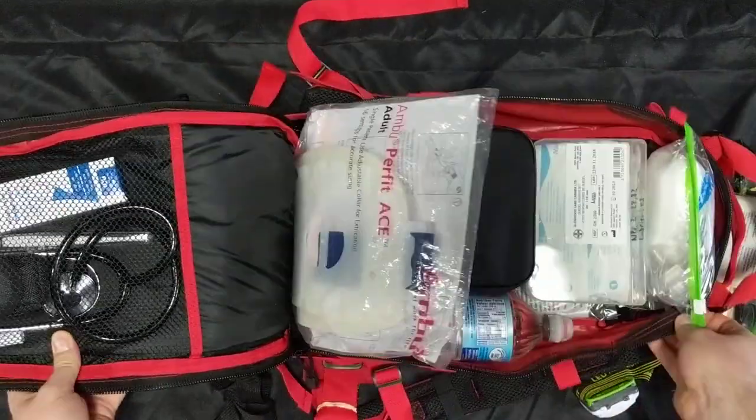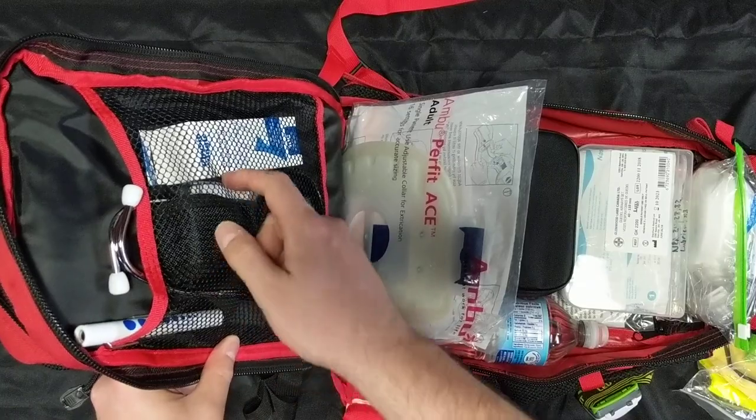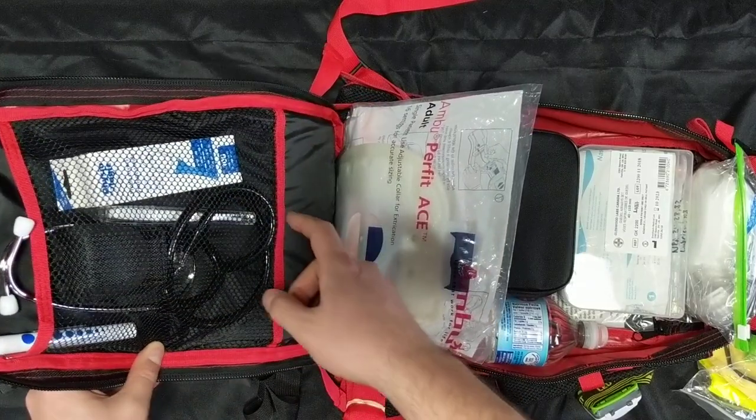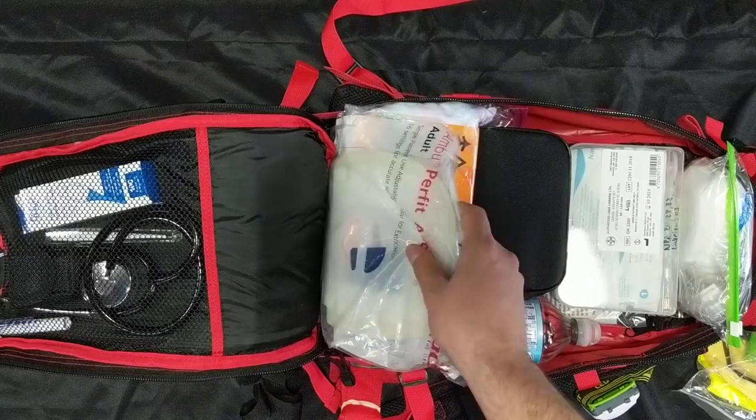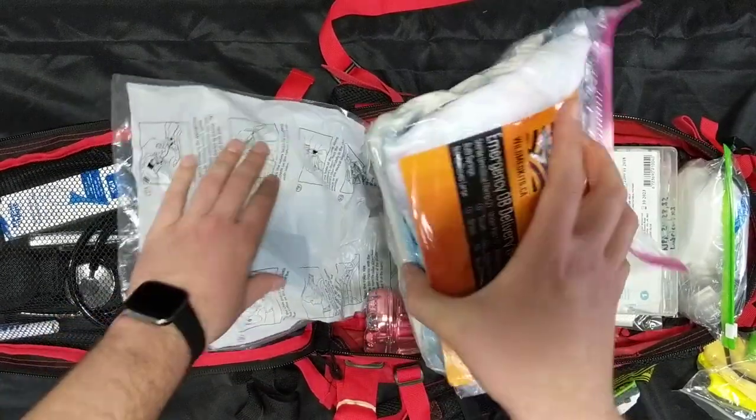In our back major pouch, which opens all the way up, the top section has assessment gear: a stethoscope, pen light, thermometer, 100 probe covers, and an SpO2 monitor. Then you've got a full adjustable cervical collar.